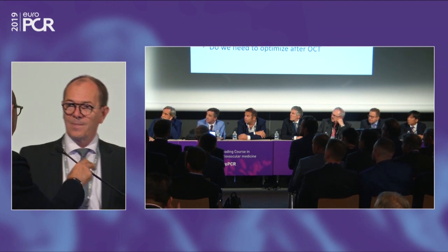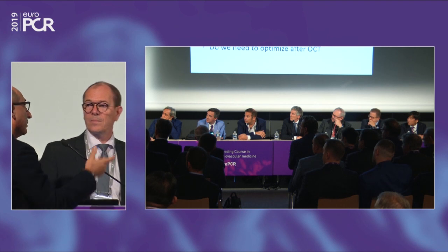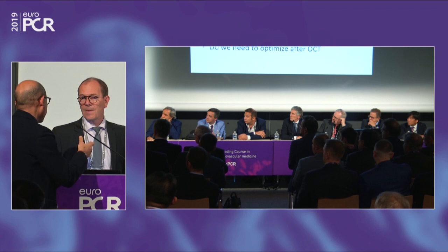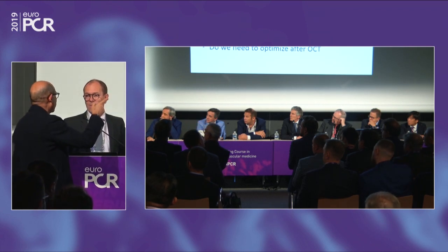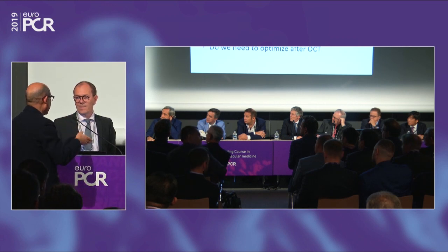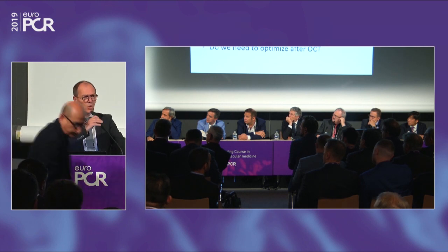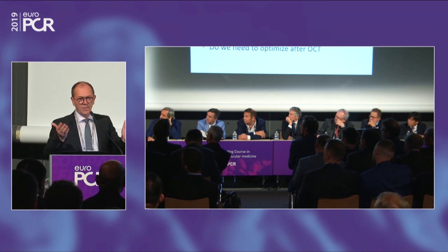Thank you for such a nice presentation. I'd like to ask you, how do you measure the left main length for optimization of your stent size? I saw that you just left the proximal part of the stent between the left main ostium and the distal part. Yes. So how do you cover the lengths? Usually I use the tip of the wire, which is 30 millimeters. Okay, so you know if you have half, you have 15.